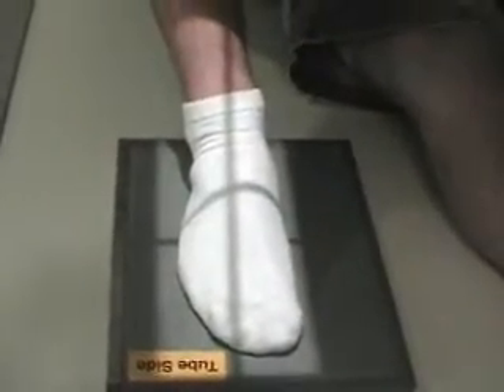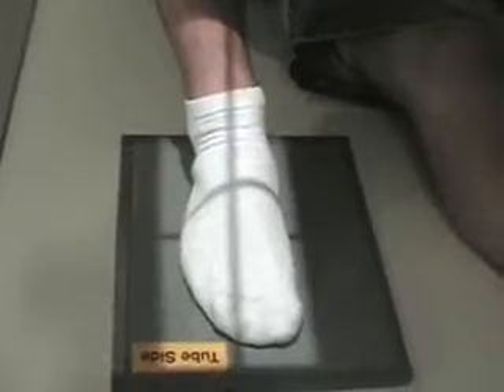Run out. Make sure I don't move. Don't move. We've got this angle. We've got the base of the third. Marker. Beep. Beep. Marker. Okay, but now we know what to do. We've got to do the leak.